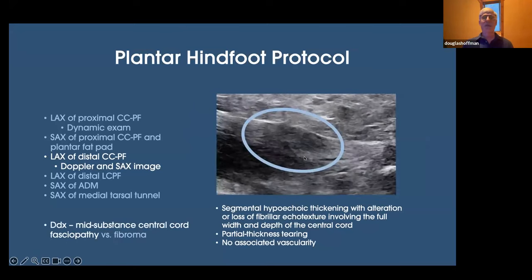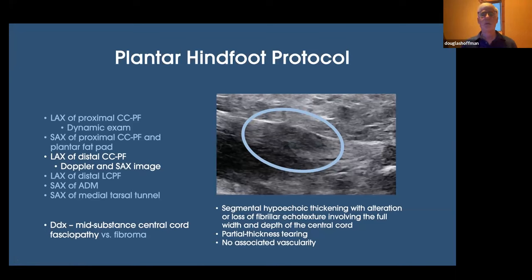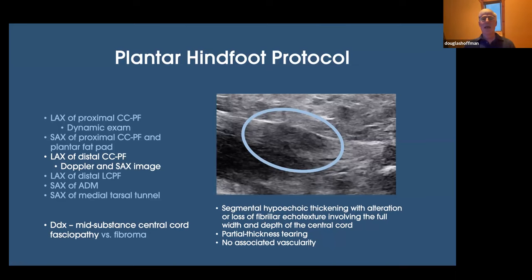Most of us who scan a lot of these see this quite a bit — these thickenings in the central cord. Is this a fasciopathy or is this a fibroma? Because fibromas are quite common. What I find interesting is that there's very little written about the details of mid-substance plantar fasciopathy. There's plenty written about fibromas, but nothing about trying to distinguish a fibroma from a fasciopathy. My goal here is to get the conversation started. We see a change in the fibrillar echo texture and disruption of that texture.